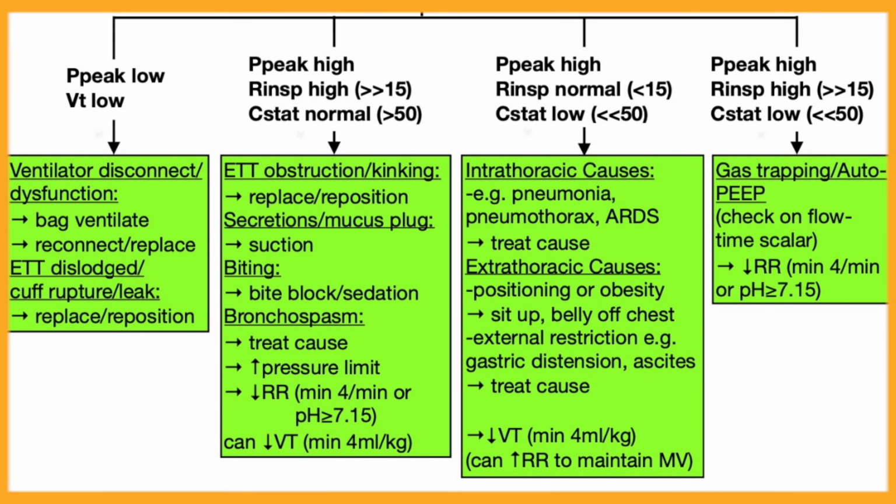To provide a frame of reference, steps 4 and 5 of the alarm management workflow for stable patients refer to this section of the troubleshooting alarms algorithm outlined in the mechanical ventilation policy. While I will provide examples of interpreting and managing high and low airway pressure, please consult the algorithm in Clinical Design for specific conditions and clinical indicators.